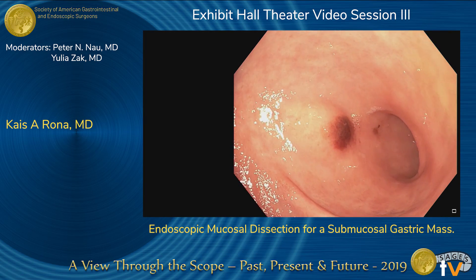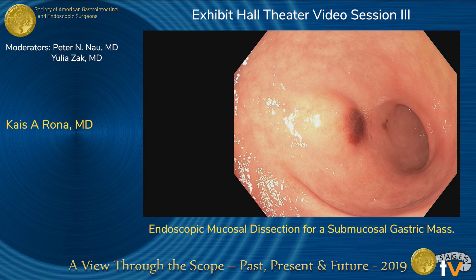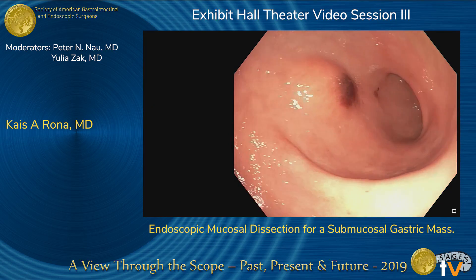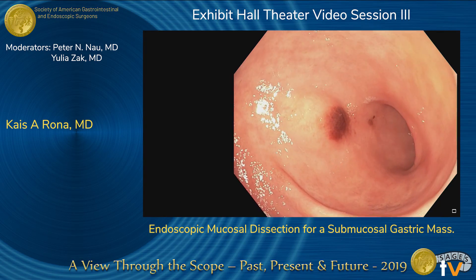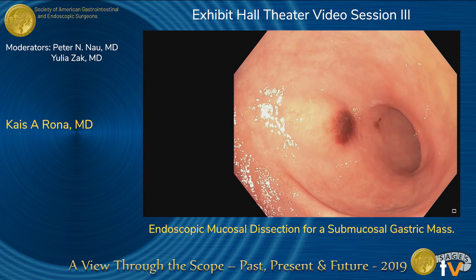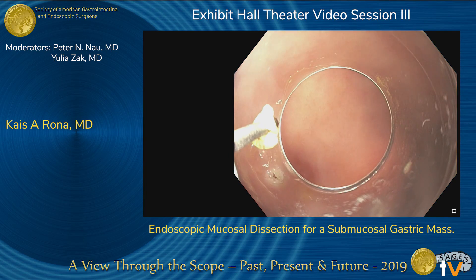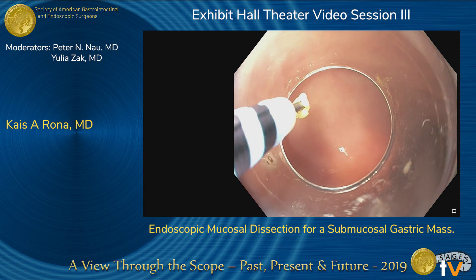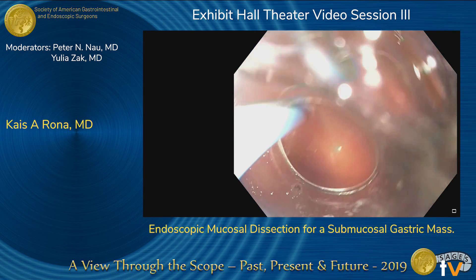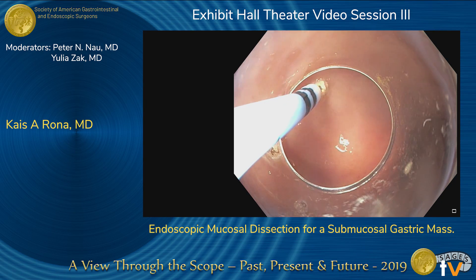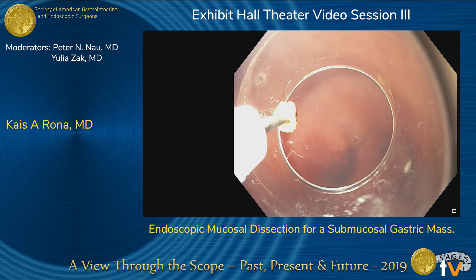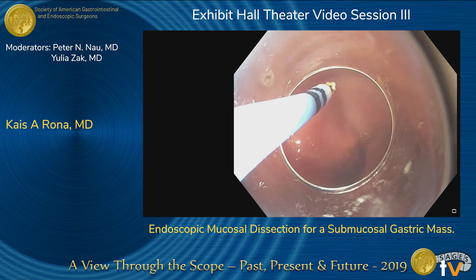Here you can appreciate the mass lesion in the distal stomach — that discoloration is iatrogenic — and you can see that the overlying mucosa is pretty much intact. For the procedure, we use a standard high-definition gastroscope with a cap attached to the end of the scope, and we have about a 2.8-millimeter working channel. Here we're using the hybrid electrosurgical knife to mark the perimeter of the lesion.